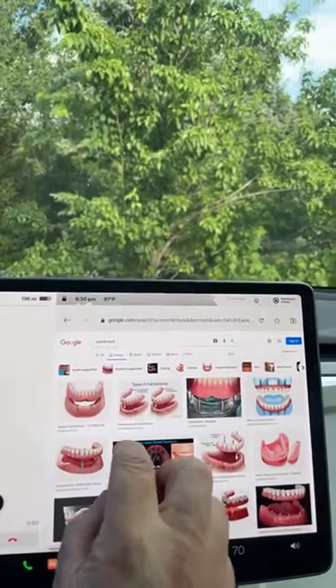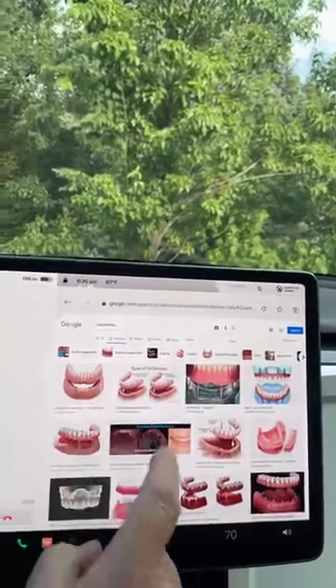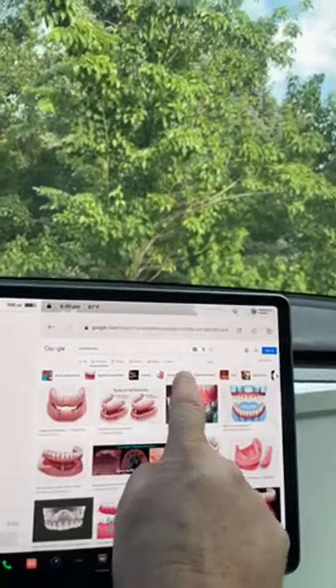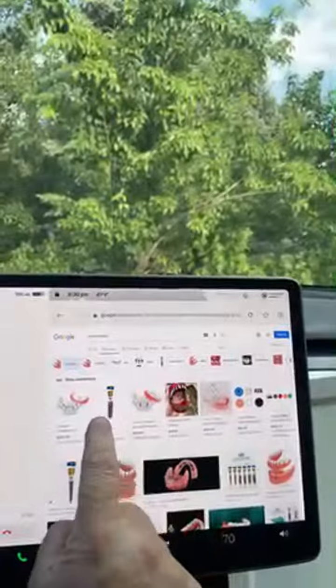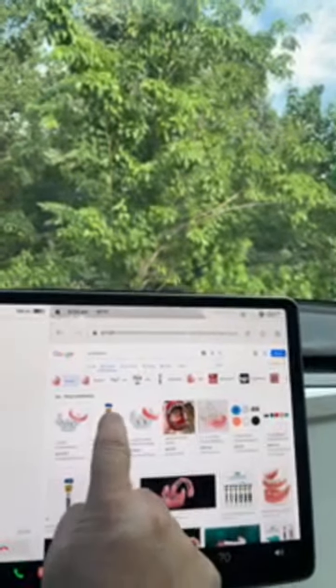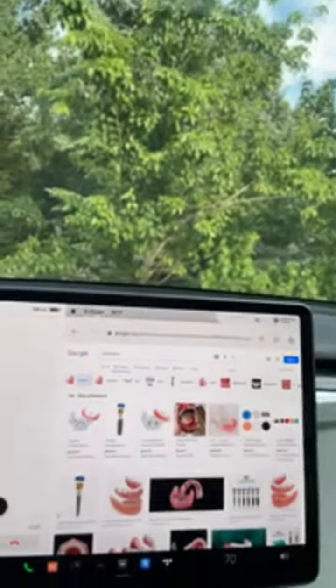Okay, so this is a regular denture, and now you don't have any bar in between. When we're talking about these, what we have attaching them is this. Now you have an implant and a male-female fitting. This is in the mouth, and that blue portion, which could be lots of different colors, is what is in the denture.